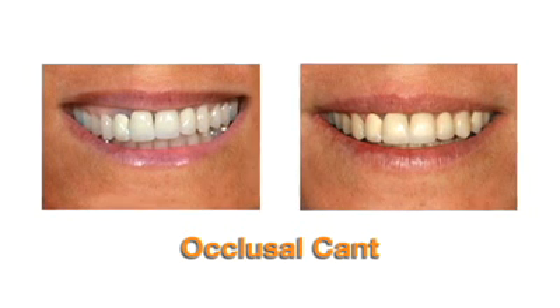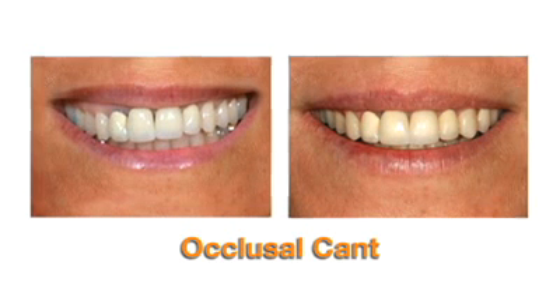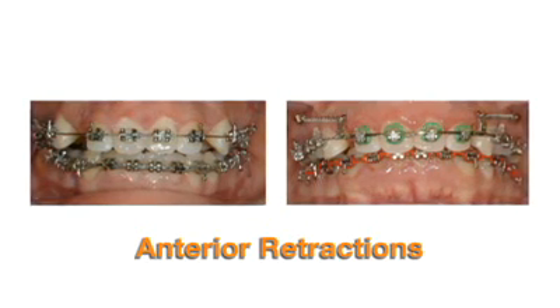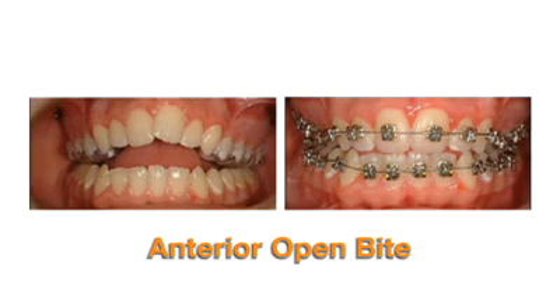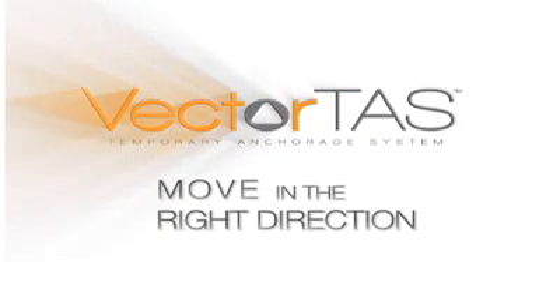Treatment of occlusal cant cases is just the beginning. With Vector TAS, you can achieve a wide range of orthodontic movements to simplify treatment mechanics for cases that may just require space closure, as well as complex cases like anterior open bites, and more. Move your cases in the right direction with Vector TAS.